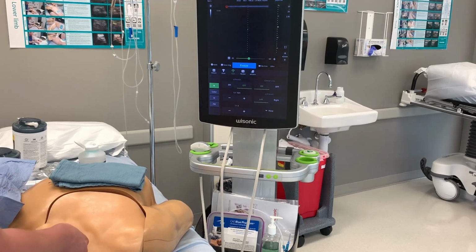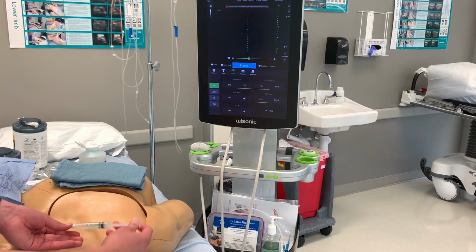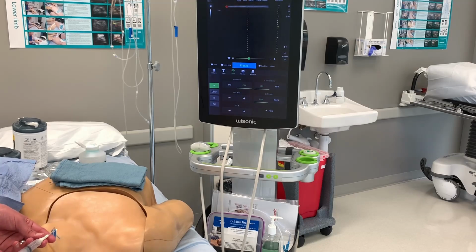And now we're just going to thread it down. There we go. And now we can check to see if we indeed still have proper placement. We can do this by pulling some fluid out of the catheter and ensuring it is still venous blood. So you notice I have air in the syringe. Again, not something you'd actually do, but there we go. We're still in because we got blue. And again, just giving it back because this is a mannequin. And there we go.